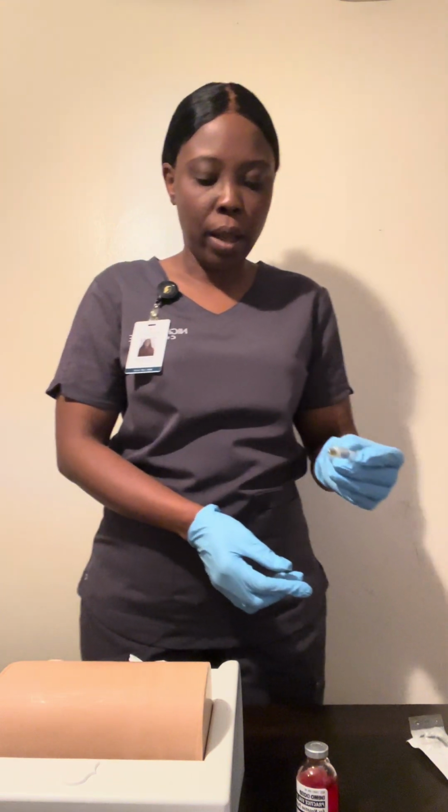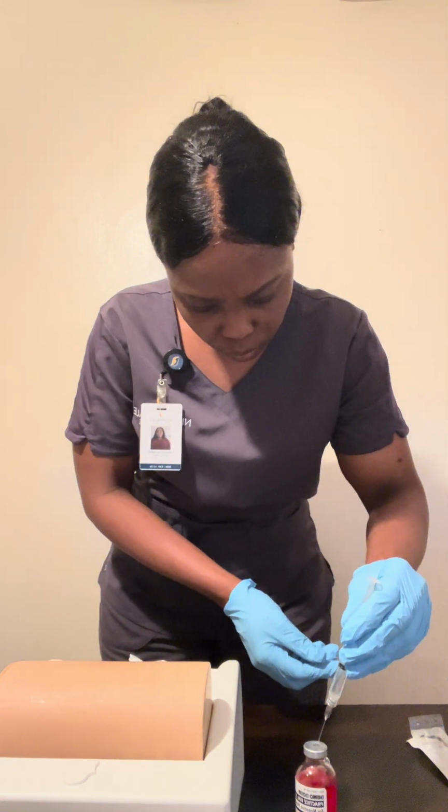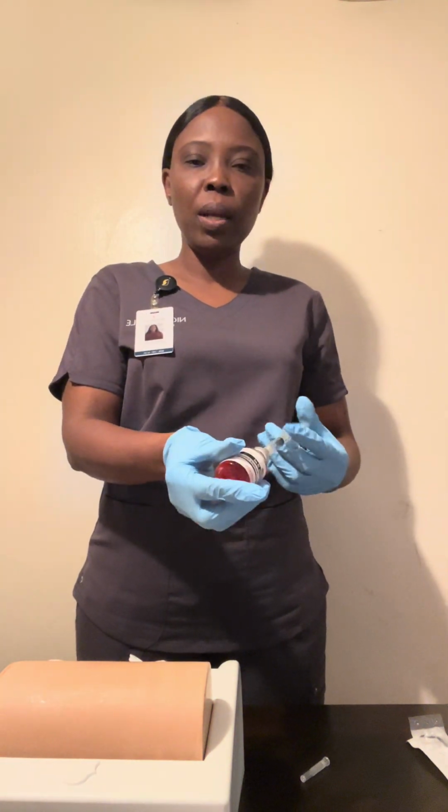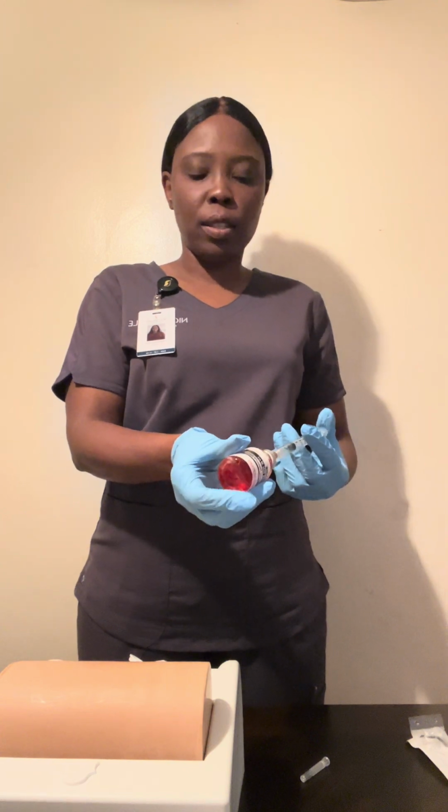And then I'm gonna withdraw 1.5 milliliters to get 6 milligrams.